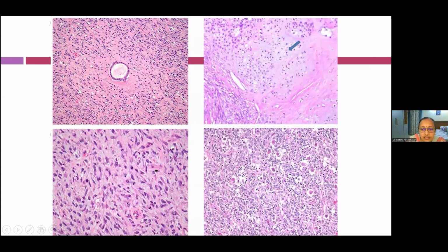So this is a malignant Phyllodes tumor wherein you can find the overgrowth of stromal spindle cells with atypia. But then you are lucky if you could find a benign epithelial duct like this, which probably gives you a hint that this could be a malignant Phyllodes tumor over other mesenchymal neoplasms. Sometimes you get malignant heterologous elements like a chondrosarcoma inside a Phyllodes tumor, and that suffices to call it malignant. But mind you, you can get these even in metaplastic carcinomas and other primary mesenchymal tumors.